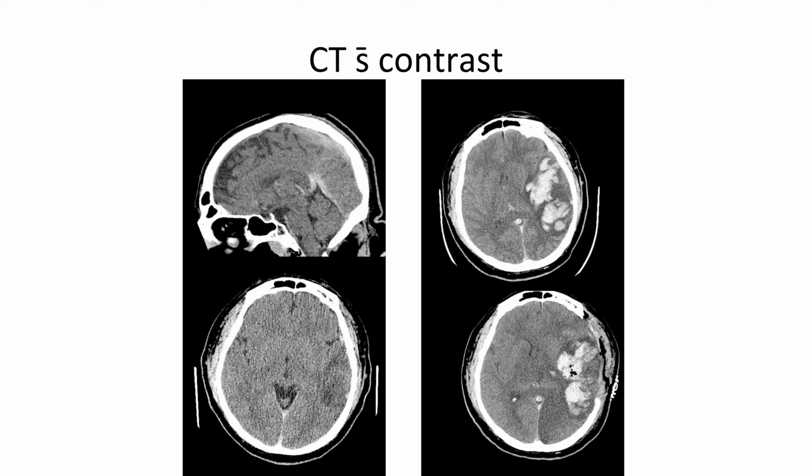Now you might think, oh, well, maybe we could put a catheter up in the vessel and use some fibrinolytic therapy, bust the clot. But you can already see that there may be a little bit of subdural hemorrhage forming as well, at the top left especially. So unfortunately, in these sorts of cases, what often occurs is after the blood is clotted, pressure can build up, and you can convert from being overcoagulated to hemorrhaging, and that's what happened in this lady.